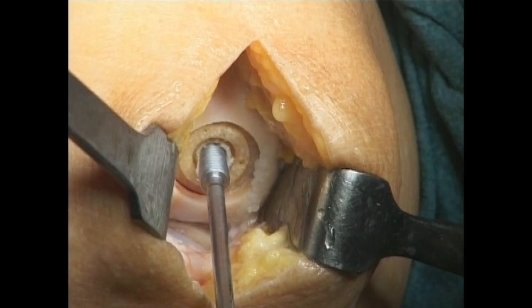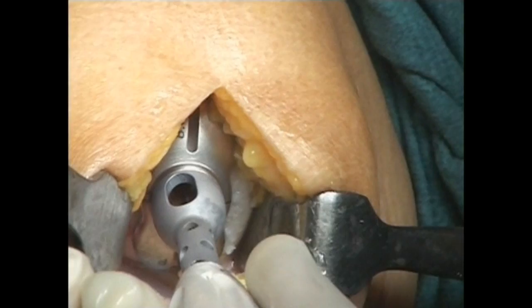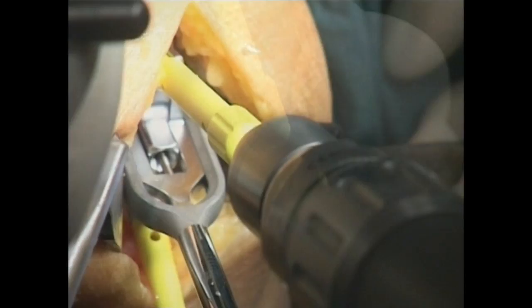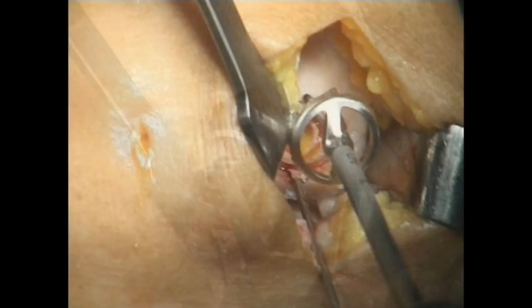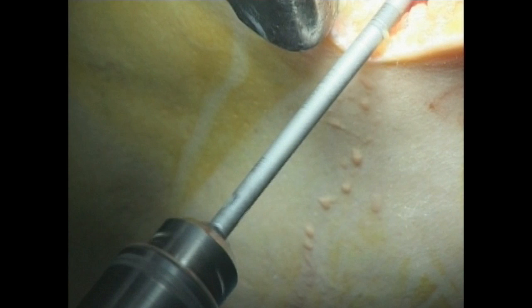The centering shaft is removed. The femur trial is temporarily placed over the threaded pin to select the appropriate size of the guide block. The guide block is placed into position. Once the pin sleeves have been inserted into the slots on the top and bottom of the femur guide block, two short threaded pins are inserted. The superior implant bed is reamed, followed by the inferior implant bed. Both reamers have a pin stop which is visible through the slotted window in the reamer shaft.